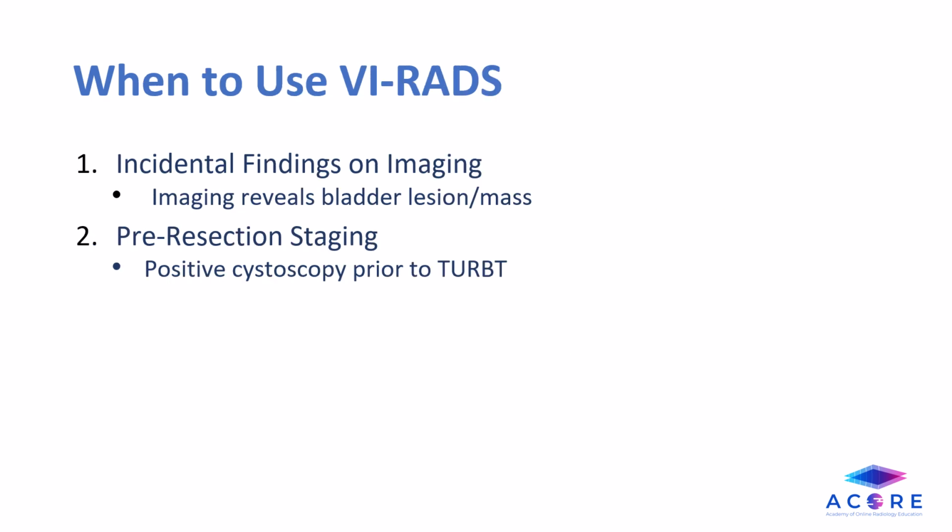In terms of patient selection, the VI-RADS scoring system is most appropriately applied in two clinical contexts. First, when bladder tumors are incidentally found on imaging, and second, for staging known tumors prior to their surgical resection.